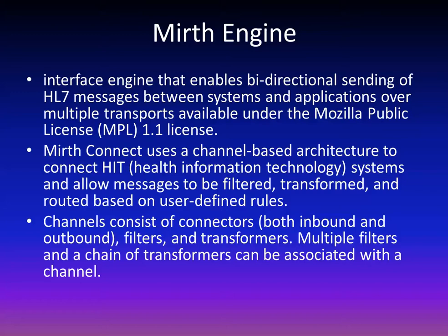So what we did is we made a Mirth engine. Right now, information goes from the modality that's taken, and it's sent through the gateway to Radius. Once it gets to Radius, we have a VPN going between Radius and our Mirth engine. When the information gets to the Mirth engine, it can pass forward onto our individual clients. So now when we want to perform an interface with an EMR, we can do the interfaces through these channels on the Mirth engine.